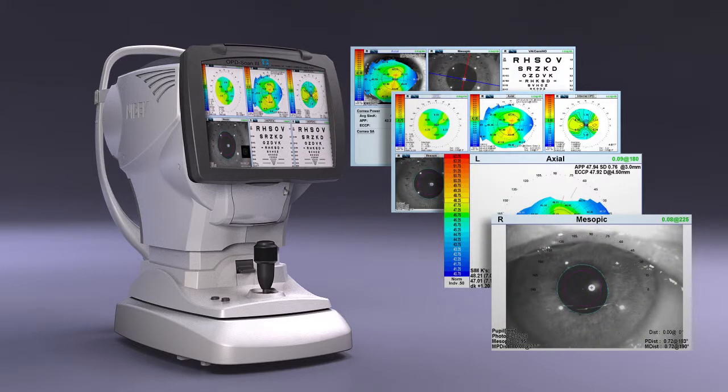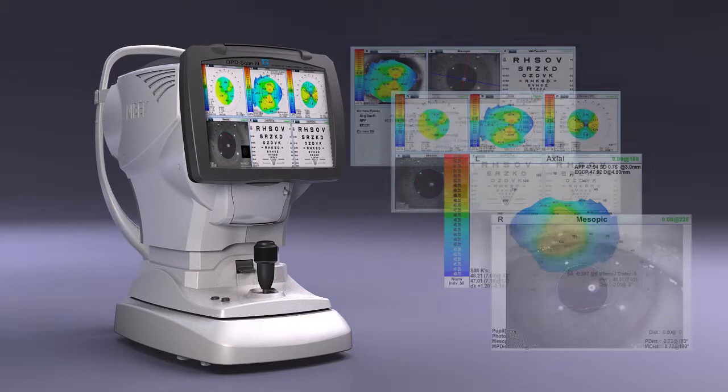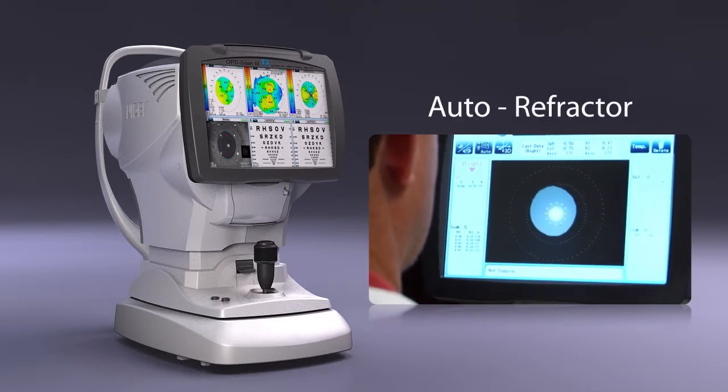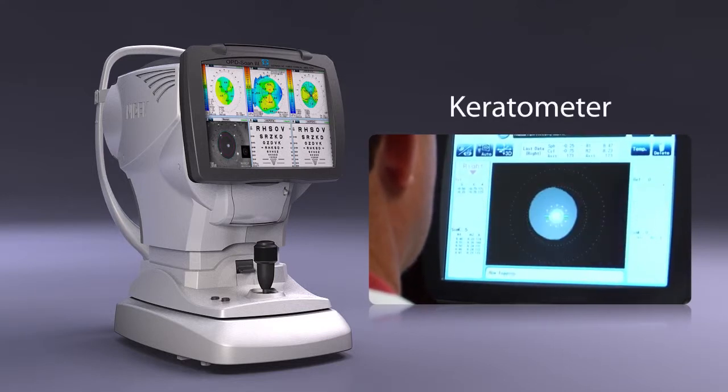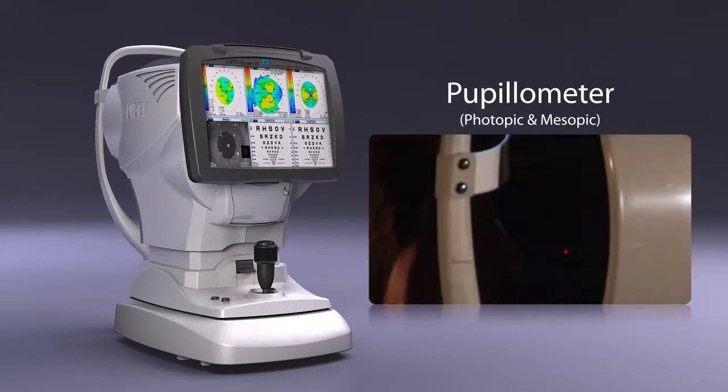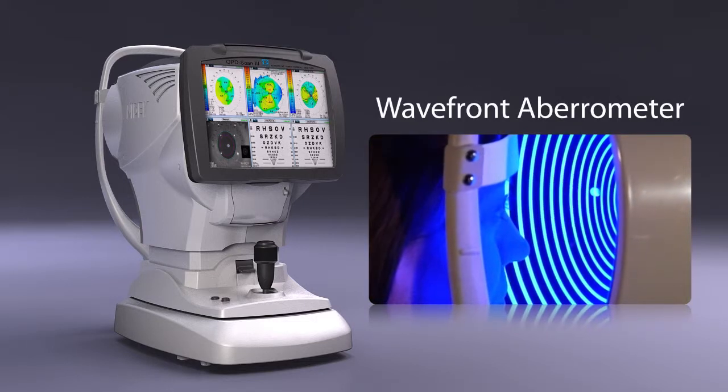The OPD Scan 3 provides you with all the data you need to perform all of these functions and much more. The OPD Scan 3 is a multi-modality autorefractor, keratometer, corneal topographer, pupillometer, photopic and mesopic, and wavefront aberrometer.